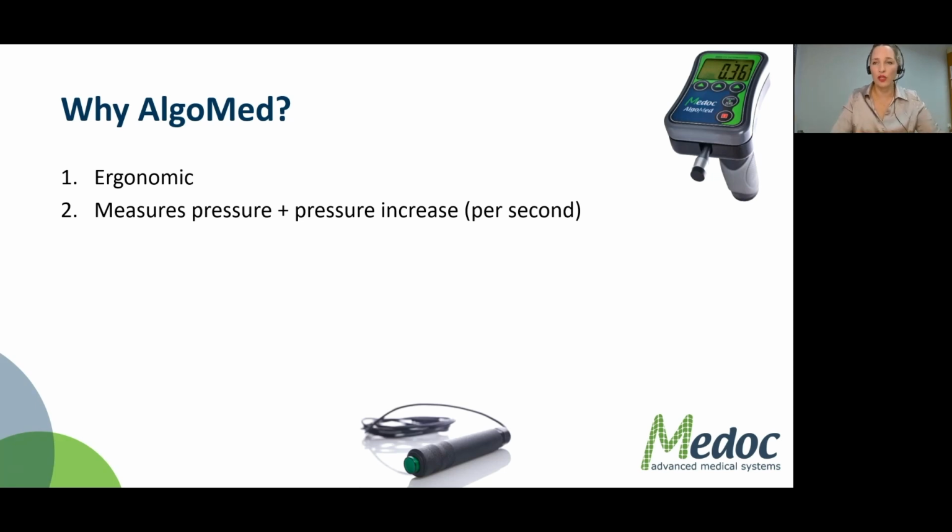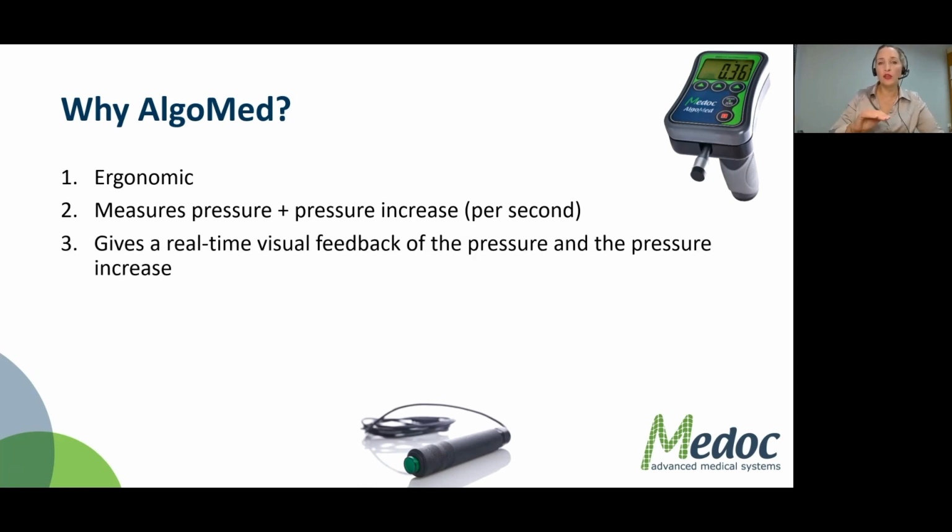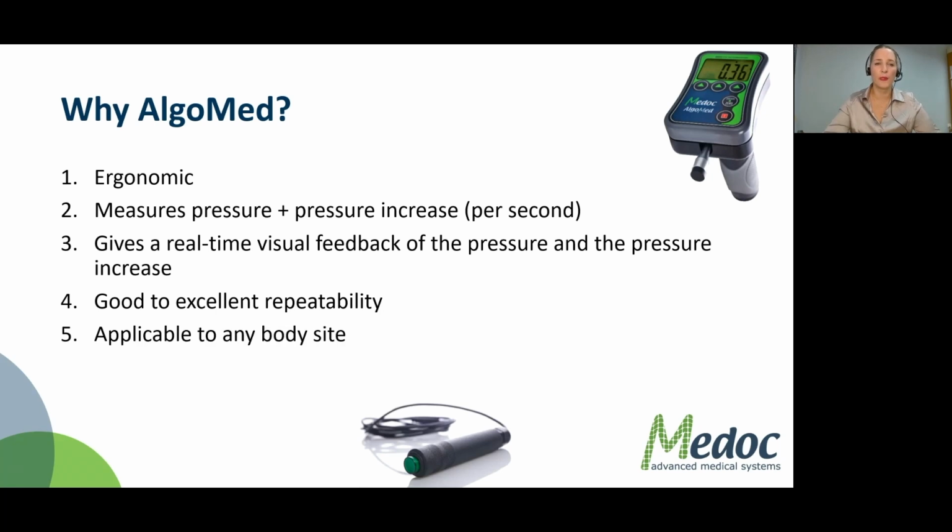It measures the pressure that you as an operator are exerting, and it also measures the pressure increase. So you know that you're giving a good, steady stimulus while you're applying the pressure. It gives you real-time visual feedback of the pressure and the pressure increase that you're applying. Not one of the minor points, it has very good to excellent repeatability in the literature, and I'll be happy to share some of those findings with you later on in this presentation.